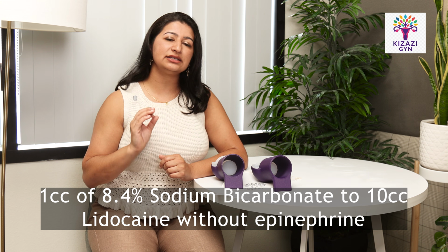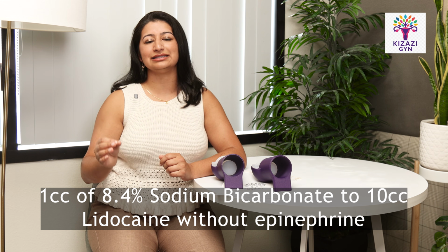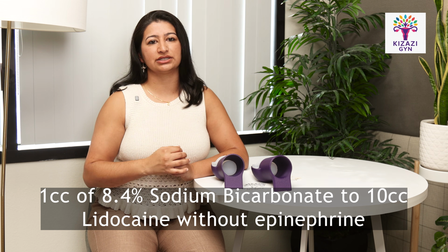I'm going to offer some tips and tricks to help make your paracervical blocks a little smoother. Tip number 1, some people like to use sodium bicarb to help buffer their lidocaine injection. This helps remove the sting for the patient and can make the whole process a little bit more comfortable. It does take a little work on your end. If you are going to use the sodium bicarb to buffer, I recommend using 1 cc of sodium bicarb, 8.4%, for every 10 cc's of lidocaine that you are injecting into the patient.